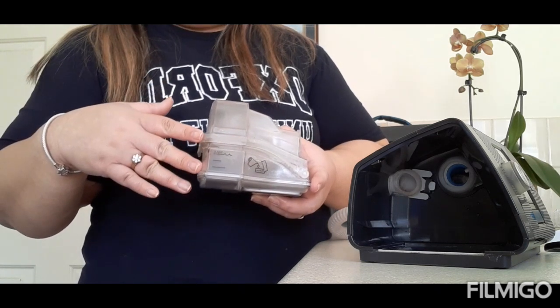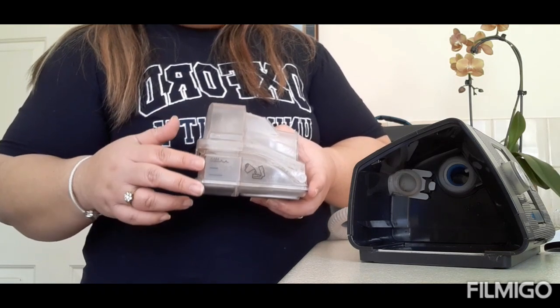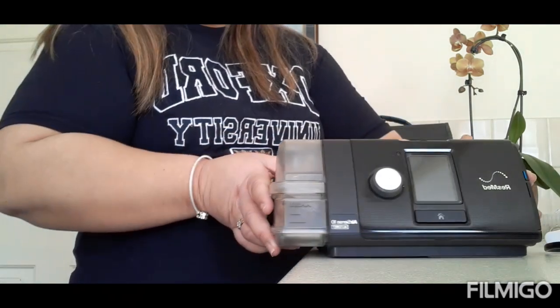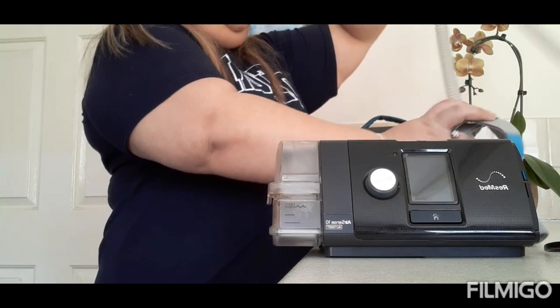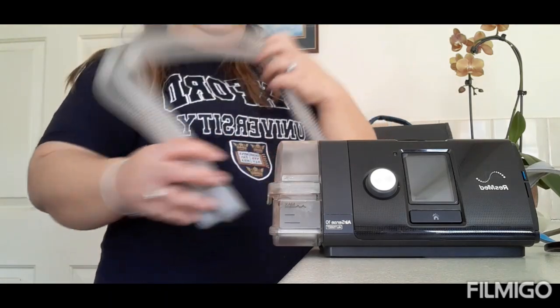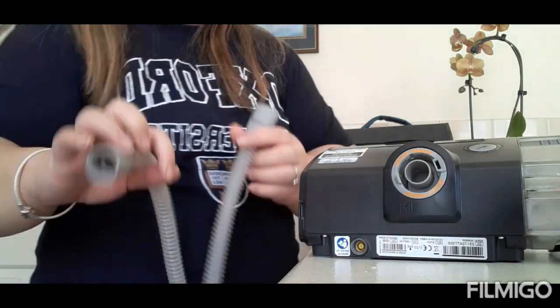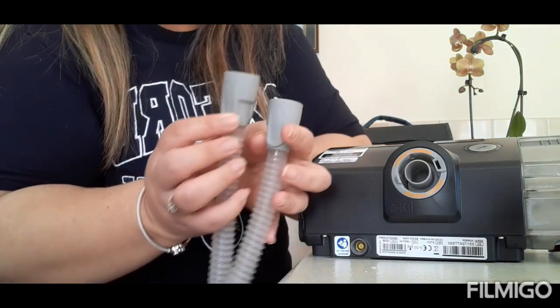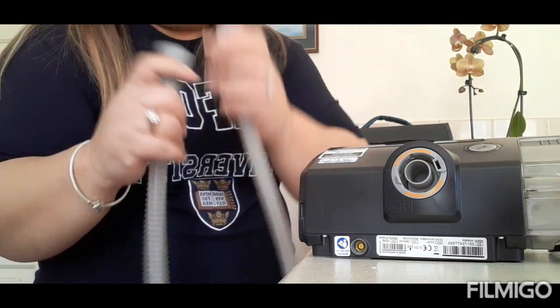Or if you don't have boiled water, you can use distilled water or mineral water, and then you just have to look at what gauge you want your water and put it inside, and then you have to slot it here on the side, and it goes like that, right? And then you have to put your hose, which is there. This is where the air flows from the machine into your mouth, and it goes like this. So I'll show you guys, right? So there's a slot in there, as you can see. There's like two sides, and they're both the same, so it doesn't matter which you put. But anyway, everything I'm showing you, they explain it to you.